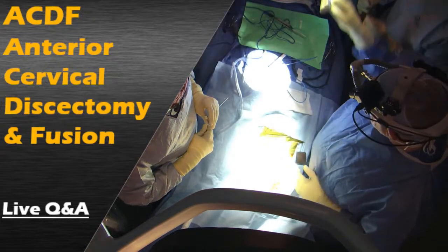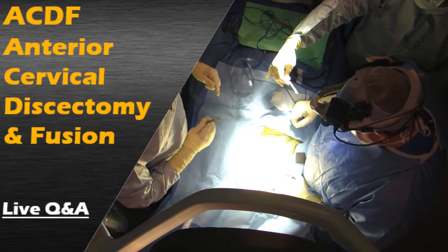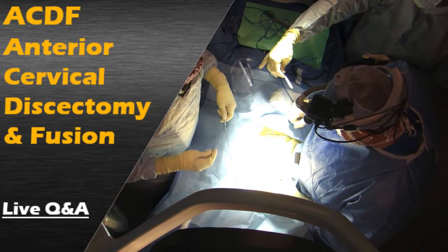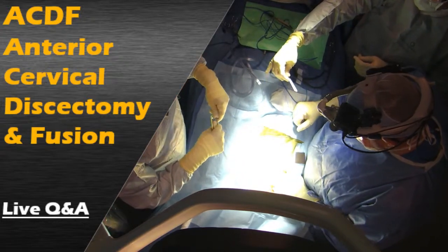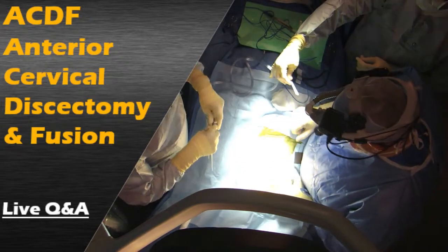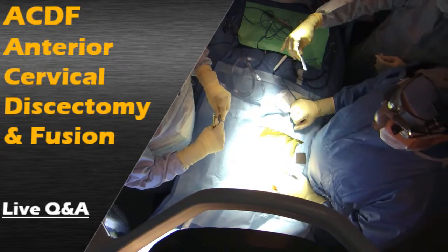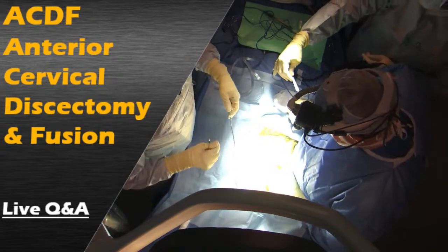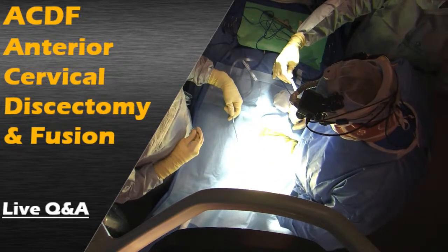We're not able to detect the fluoro, and we're not able to see the anatomy we need to see in a lateral view. So we're going to have to start up a little higher to count down and make sure we're at the right level. We're fixing C6-7. He has a very short, very thick neck and very big shoulders, so the lateral view on x-ray is very poor. We're going to need a bigger exposure to make sure that we are at the right level.